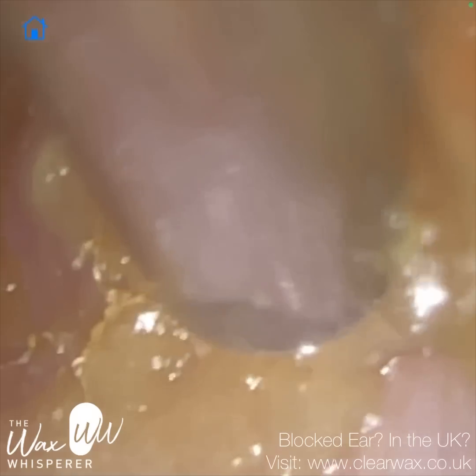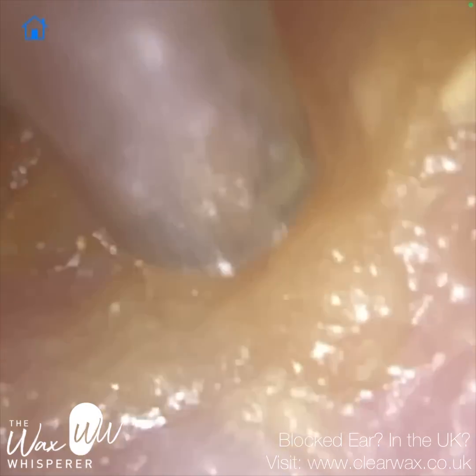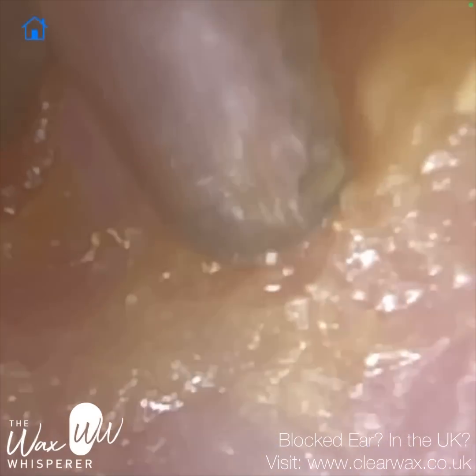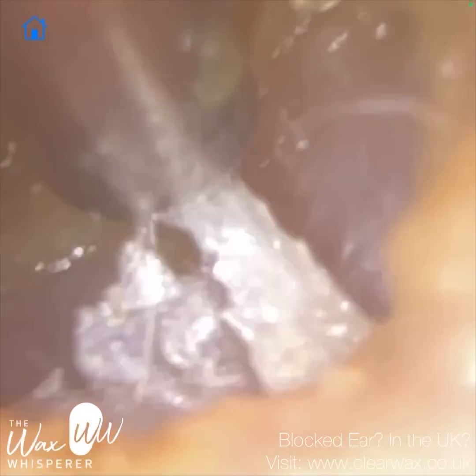I'm just zooming in to the side of the ear canal walls. I just want to hover over this dead skin, just kissing the surface. We've got to be careful that we don't poke and prod, because that will hurt the patient. Just some skin at the entrance — I'm going to peel that away.